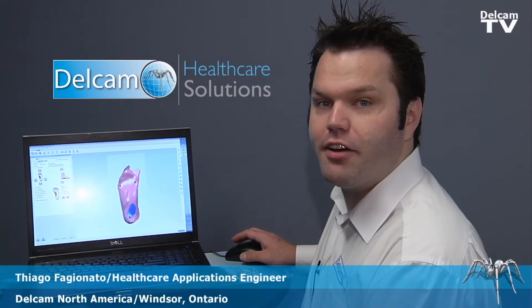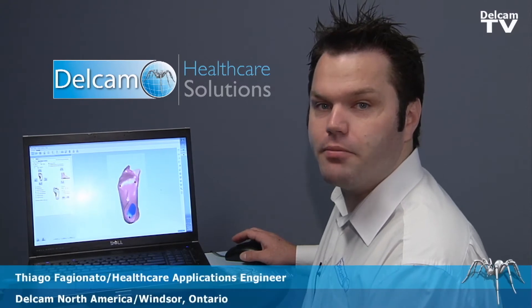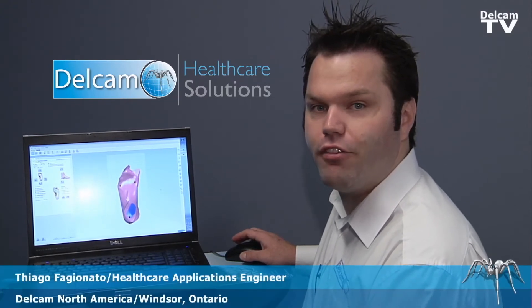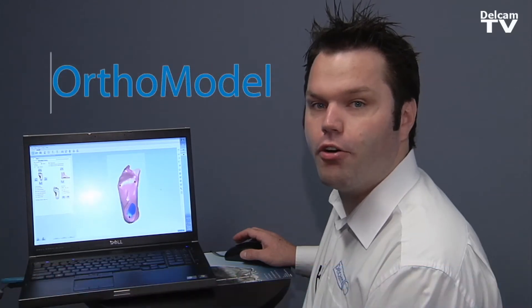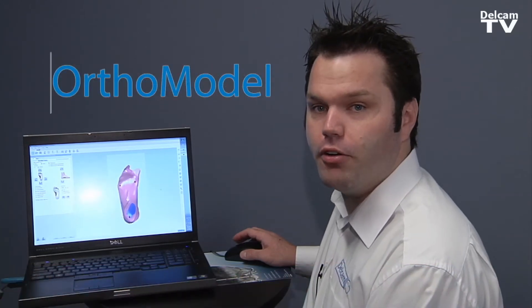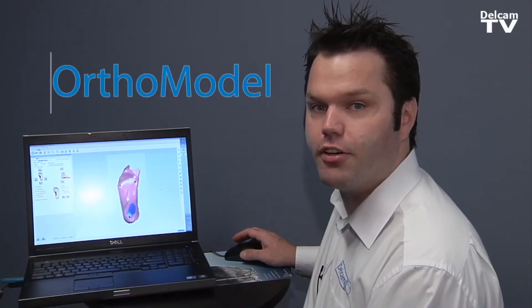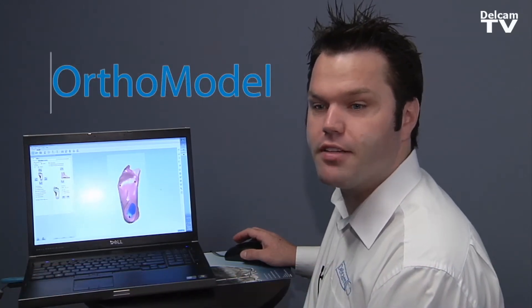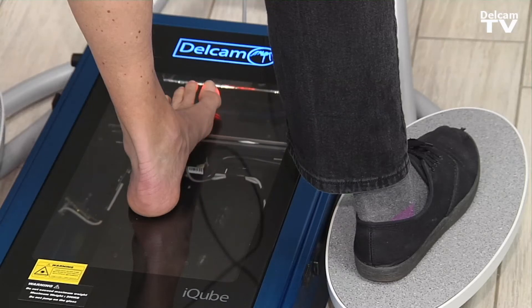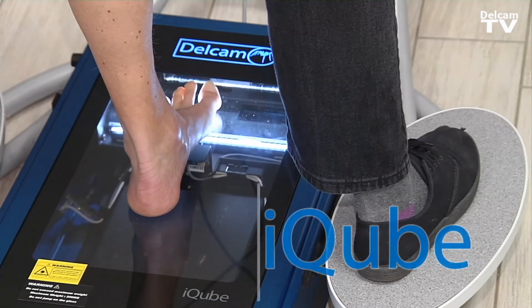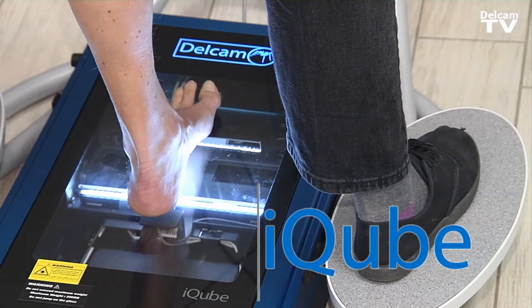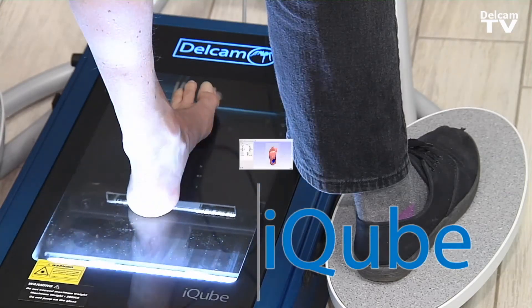Hi, I'm Thiago Fagionato, Healthcare Applications Engineer for Delcam North America, and I'd like to show you OrthoModel on how to design orthotics based on the foot scan that we will get from the iQube system.